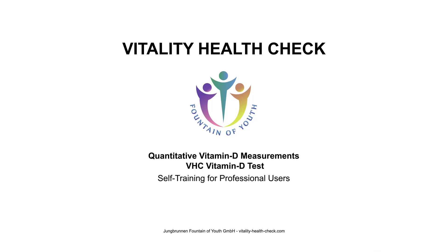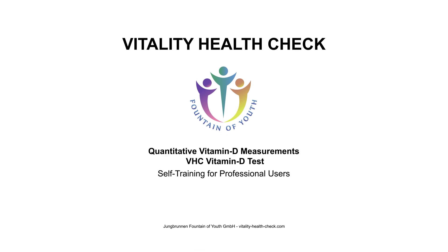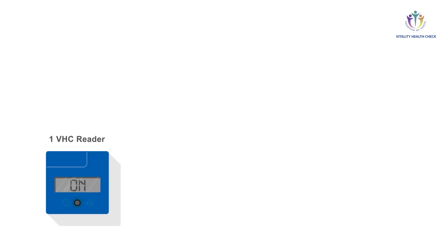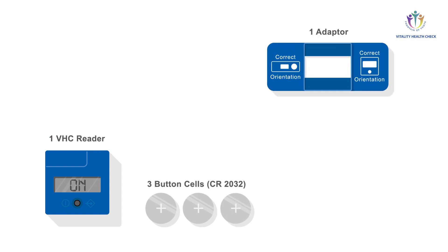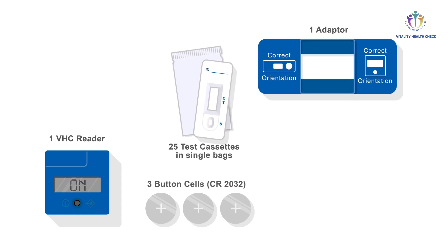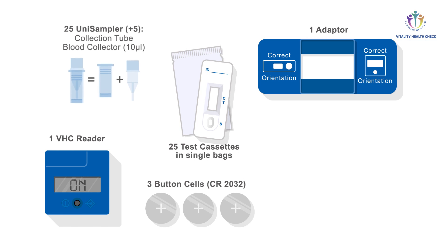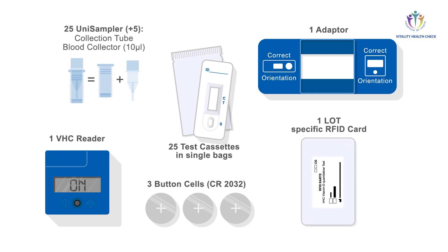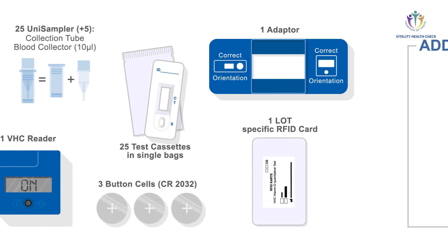VHC vitamin D test components provided to perform quantitative vitamin D measurements: VHC reader, three button cells, adapter, VHC vitamin D test cassettes, unisampler, and the lot specific RFID card.